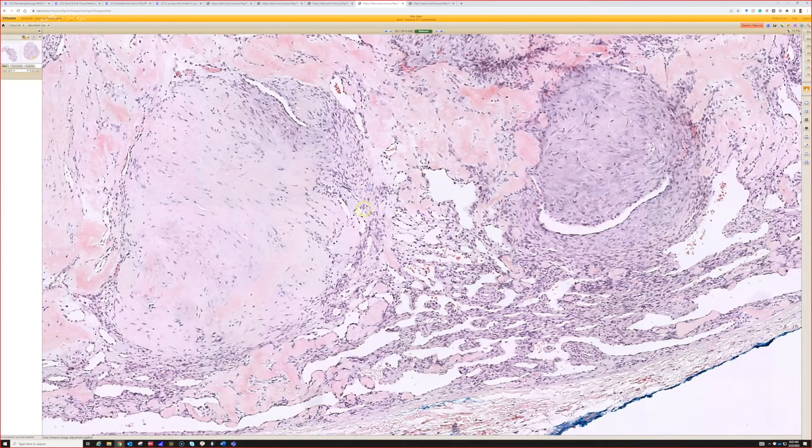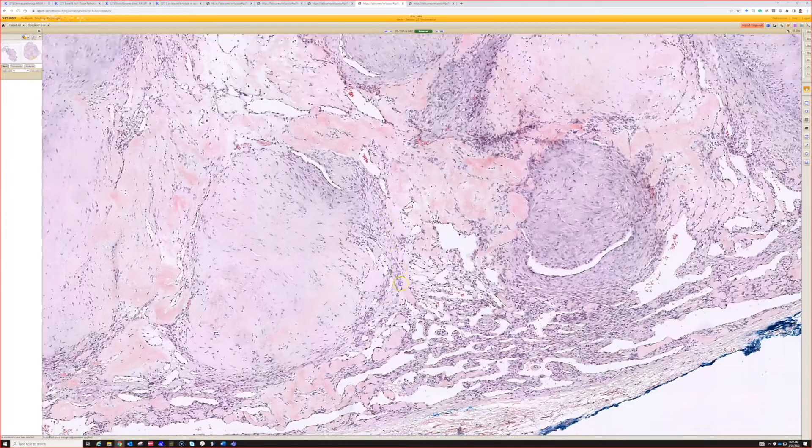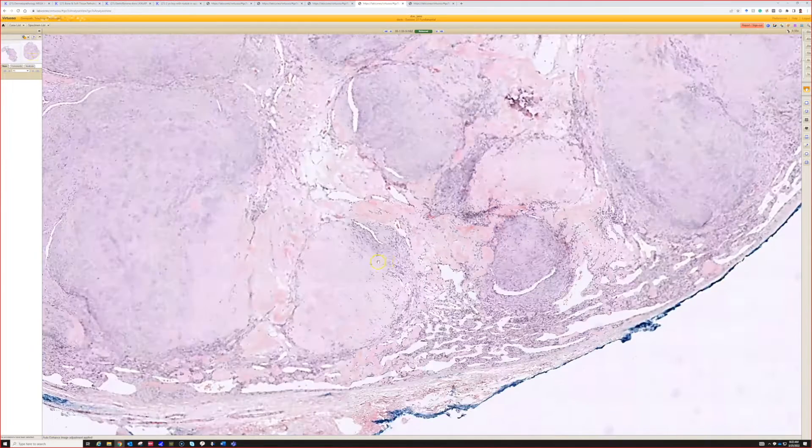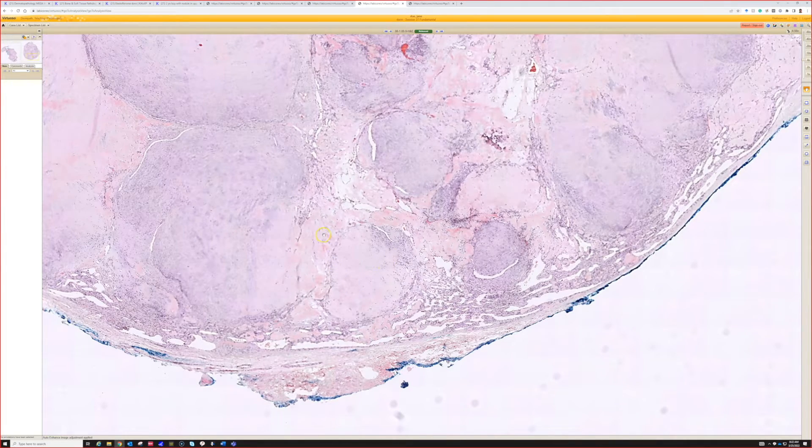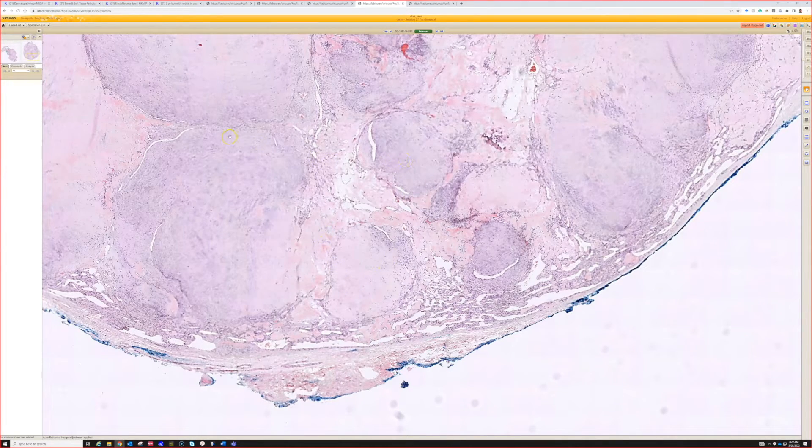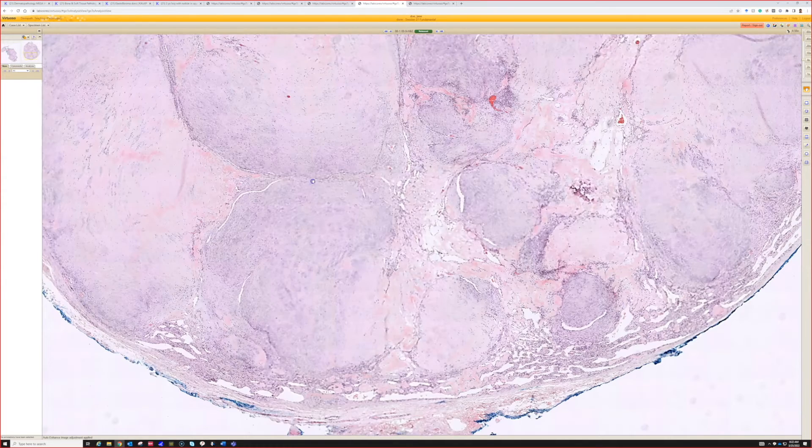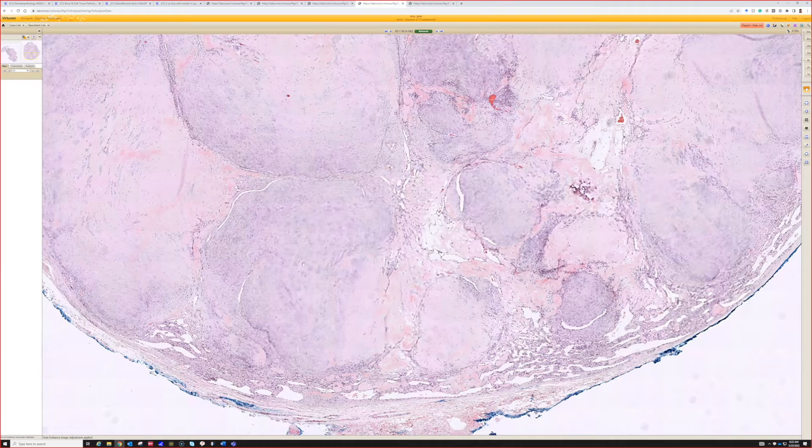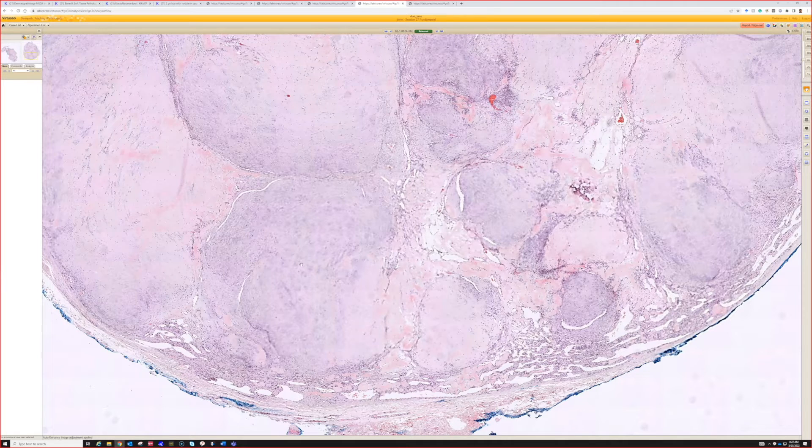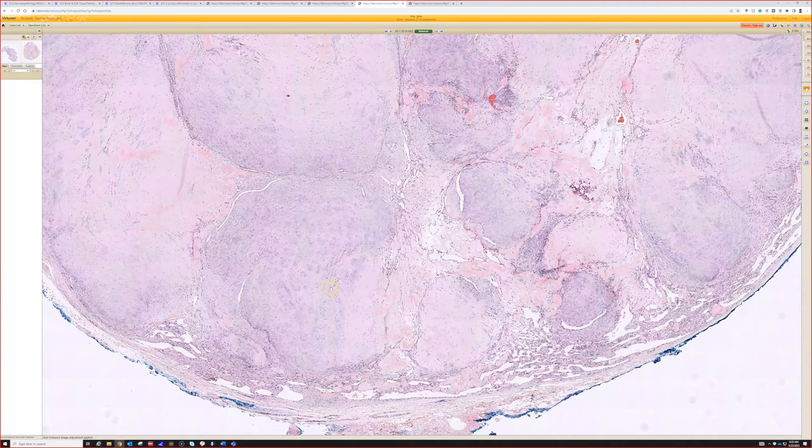The classic finding - this is a very classic example. There are variants that look quite different, but this is the one to learn myofibroma on. You get these big nodules, called myoid nodules, but I don't really love that name because they don't look like muscle at all to me.